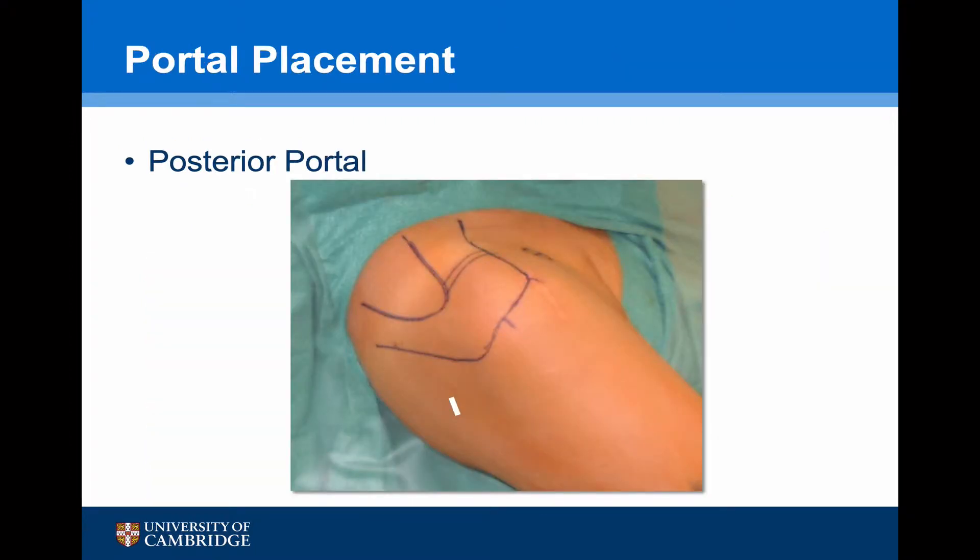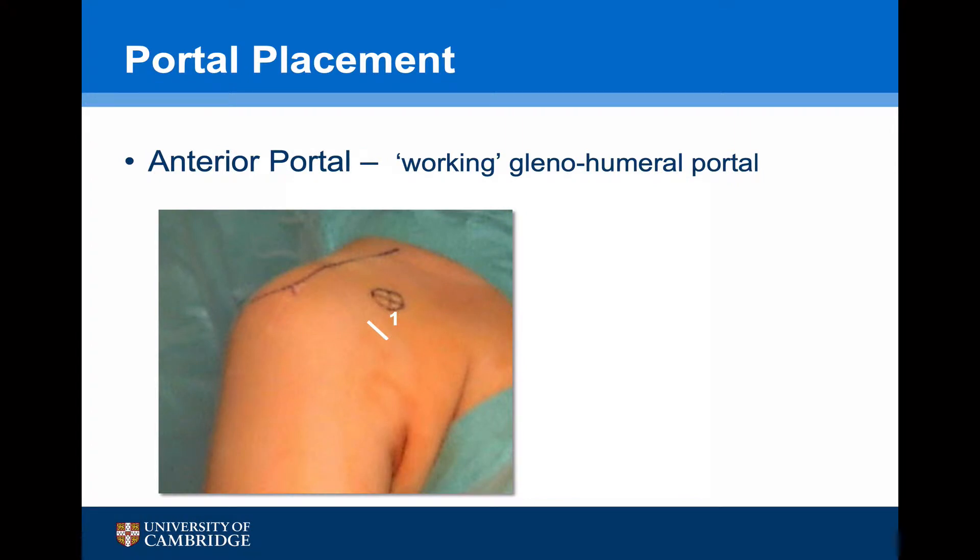The initial portal is a posterior portal. It's important to remember that the scapula lies at 30 degrees to the anterior plane, so for the portal to lie parallel to the glenoid surface, the scope needs to be directed towards the coracoid process. An anterior portal is required for anchor access, established by an outside-to-in technique at the inferior edge of the rotator interval just above subscapularis. A second portal for suture management is positioned at the superior part of the rotator interval.